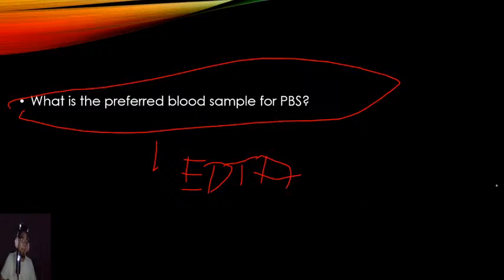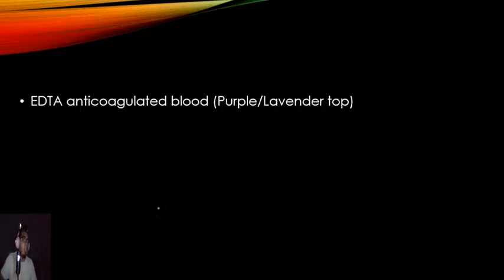Now, if you're using capillary blood, it could be wonderful for malarial smears. But ideally, your blood sample should be EDTA. Okay? Purple or lavender top. Venous blood sample.